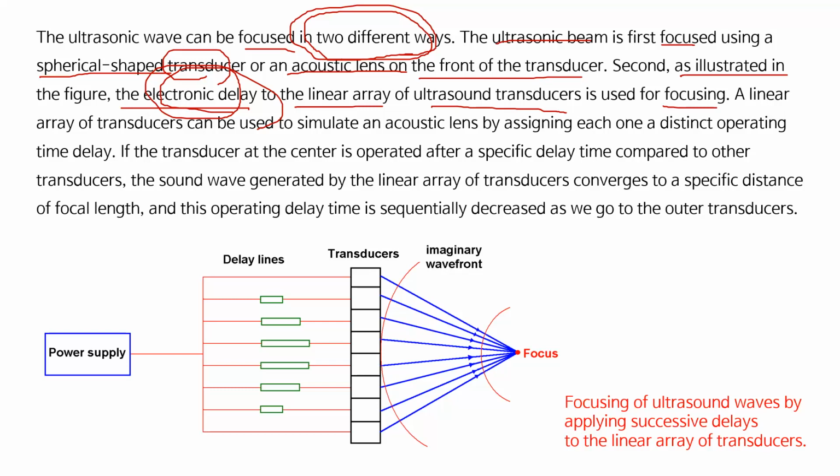So we use the array of ultrasonic transducers and use the delay of emitting the ultrasounds.